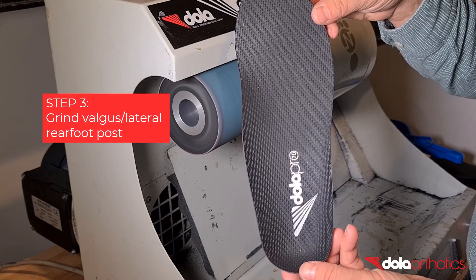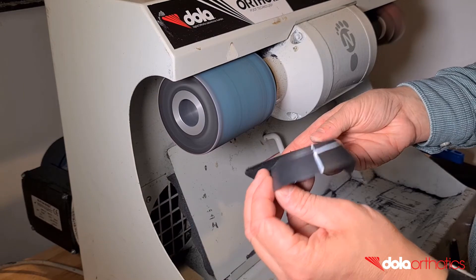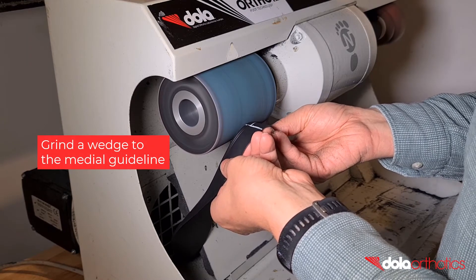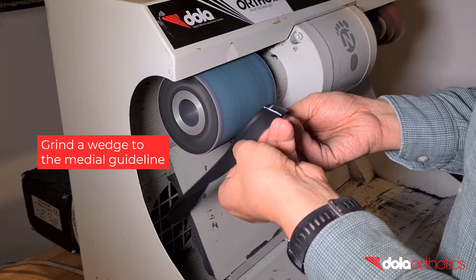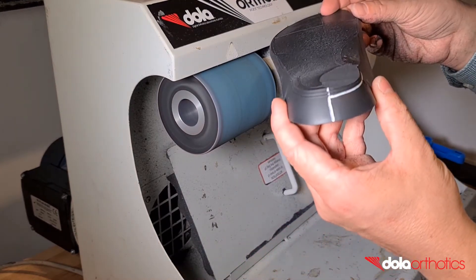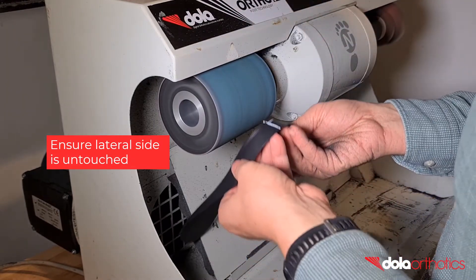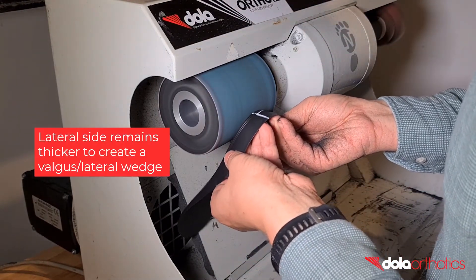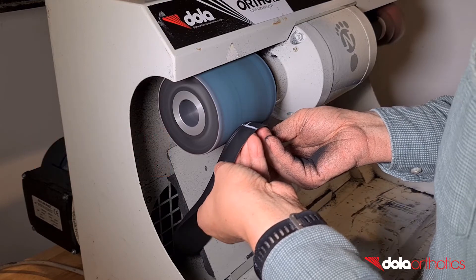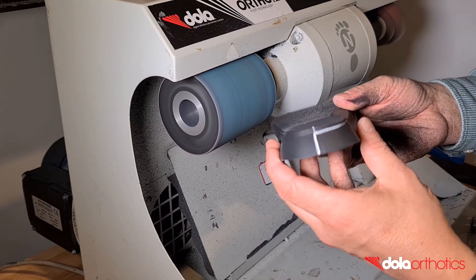The aim of grinding is to remove the orthotic shell material from the medial heel up to your guideline and blend it at a gradual angle to the lateral side, leaving the lateral border untouched. Holding the medial and lateral sides of the orthotic shell, place the posterior plantar heel surface of the orthotic against the grinder. Hold the orthotic at an angle and remove material up to your medial guideline, ensuring that this angle keeps the lateral side untouched. The lateral side will remain thicker than the medial, creating a valgus or lateral wedge. Remove small sections of the orthotic at a time until you become comfortable, and check your progress against your guideline.